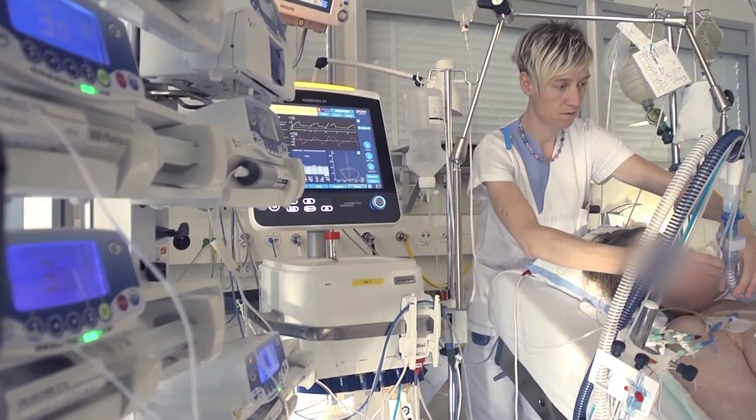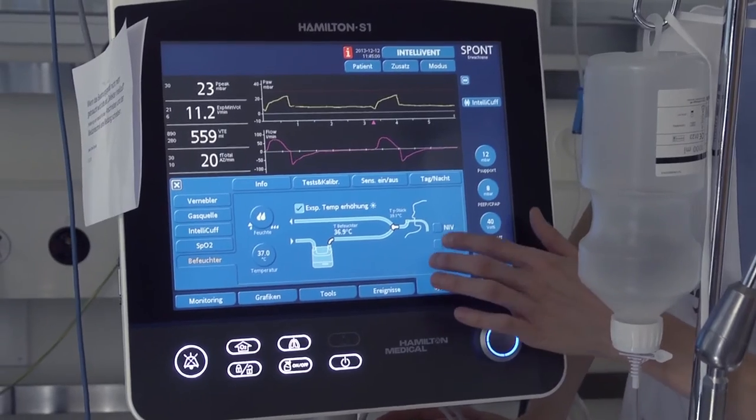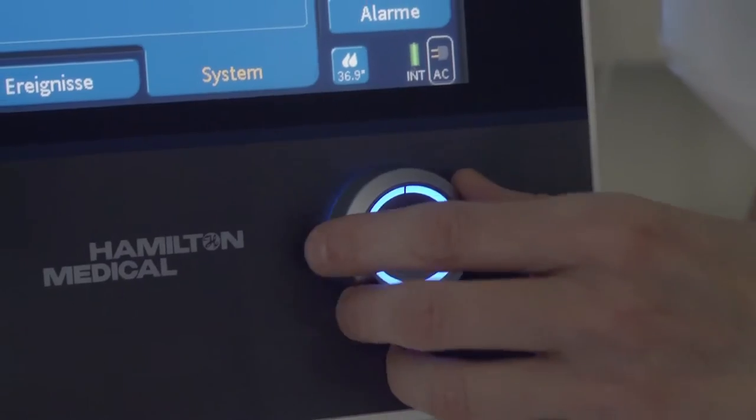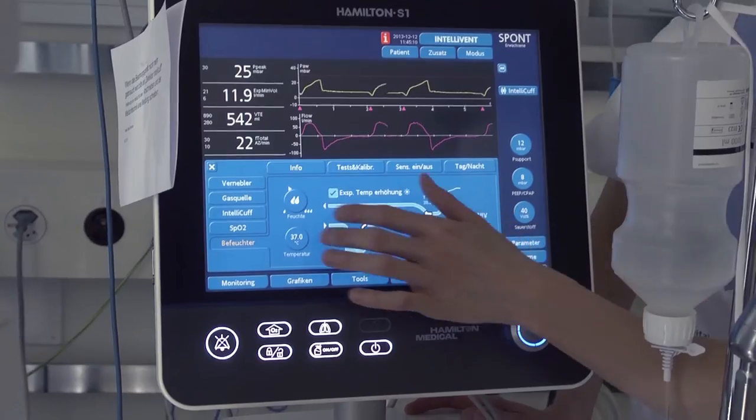The unique connectivity option for ventilators allows users to operate the humidifier from any compatible ventilator. All settings, monitoring parameters, and alarms can be controlled from the ventilator.